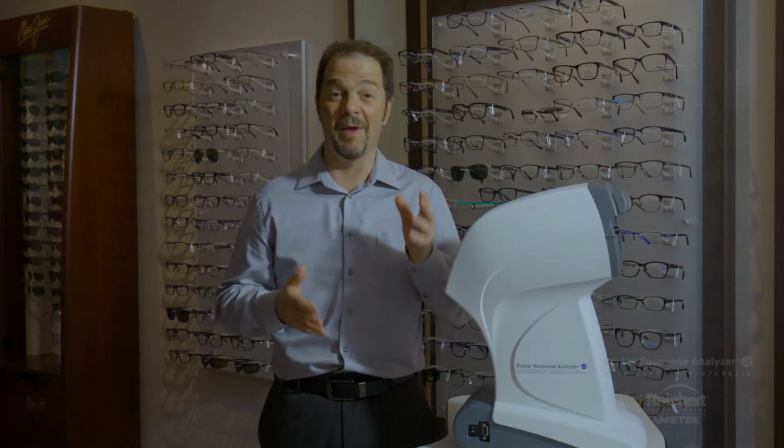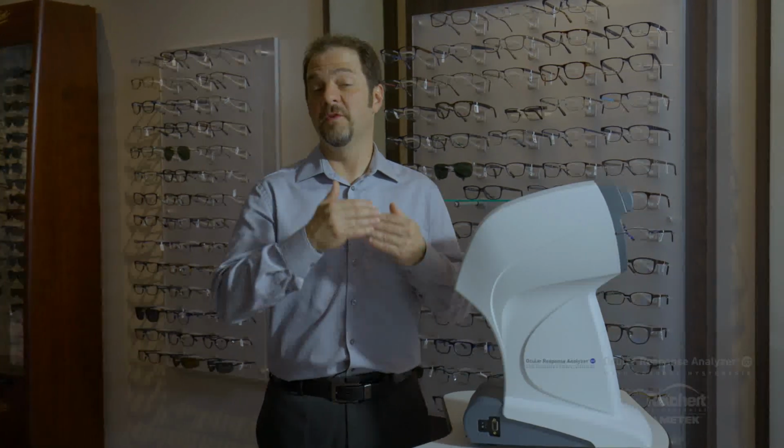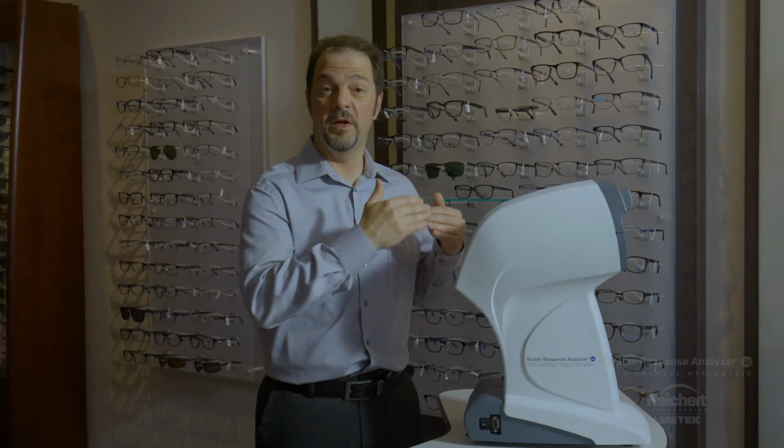The direction of the agreement or disagreement between Goldmann and IOP-G should be quite random, and it should also be fairly small in most of your patients. So if you're seeing a large offset between IOP-G and another tonometer in your practice, perhaps one of those two devices needs calibration or service.